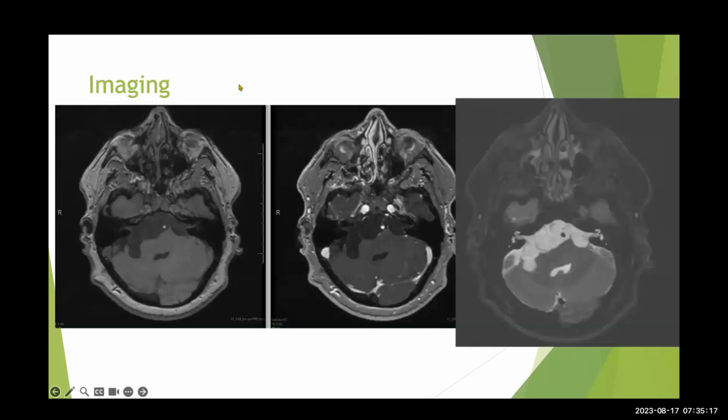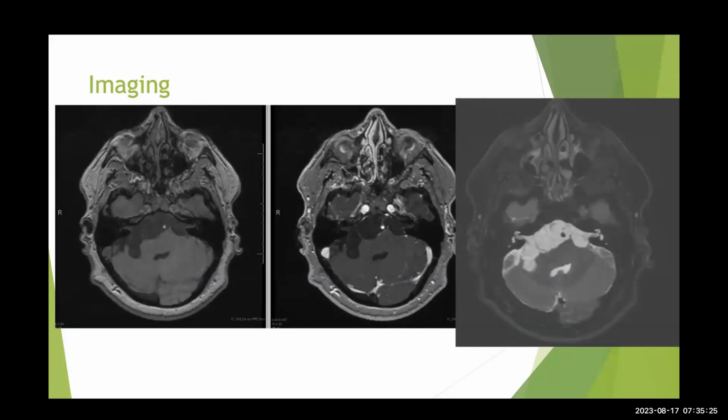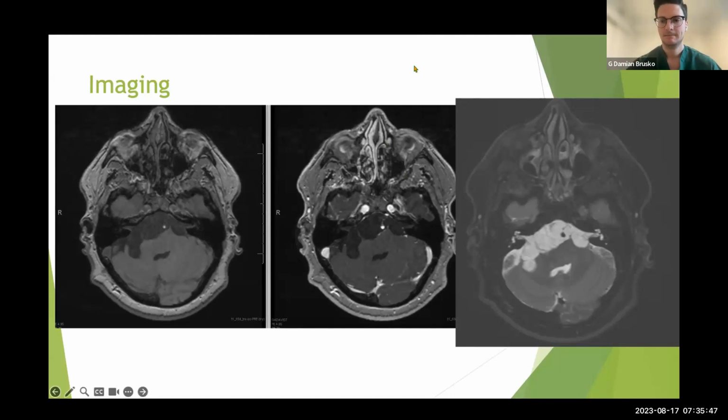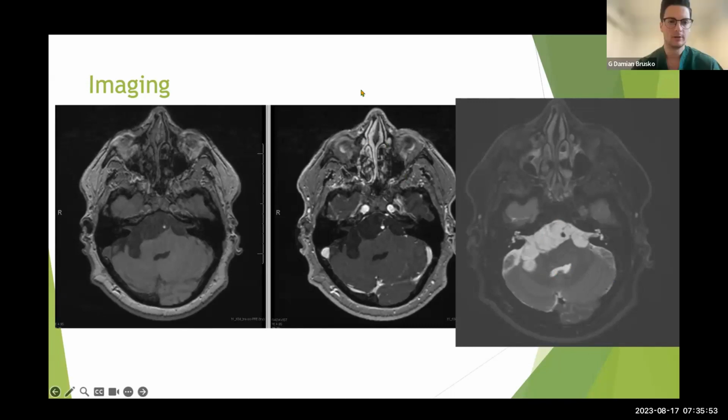So here's the MRI. What are you looking at here? So on the left looks like a T1 without, then T2, looks like a T1 post in the middle, and then I'm assuming there's a diffusion on the right. No, FLAIR. Just a T2, yeah, CSF here is T2 hyperintense. Okay, so describe what you see between the sequences here.